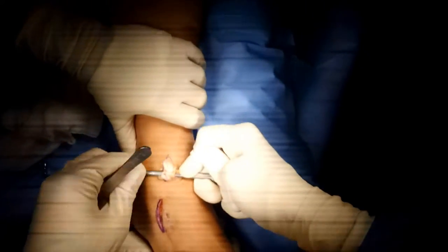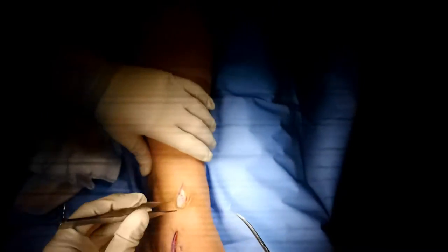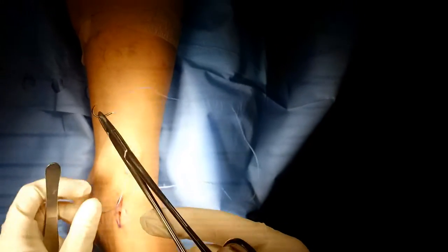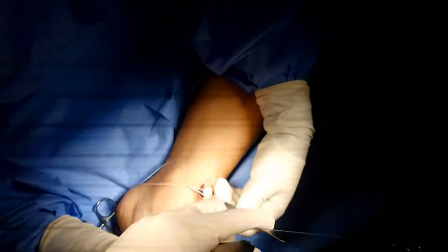After the tendon comes out, you're going to utilize a suture in order to pass it through that incision line distally. I typically use a number two FiberWire for these repairs. You can use any type of technique that you like — I'll typically use a modified Krackow. The advantage of using this minimally invasive technique is that it allows for quicker healing, faster recovery, less pain, and less scarring.